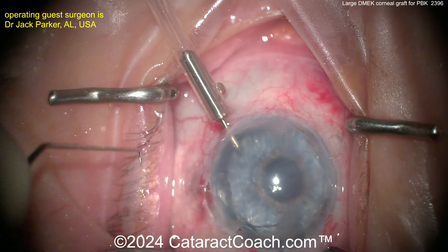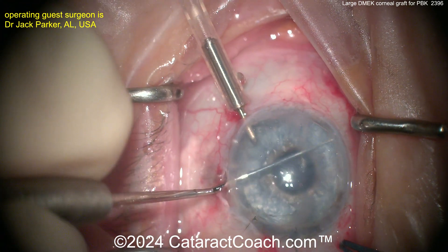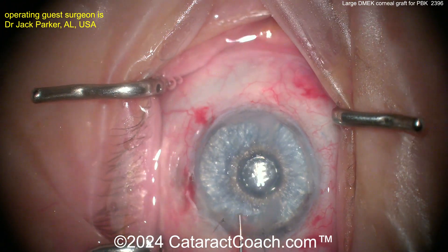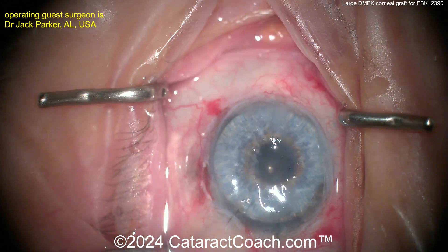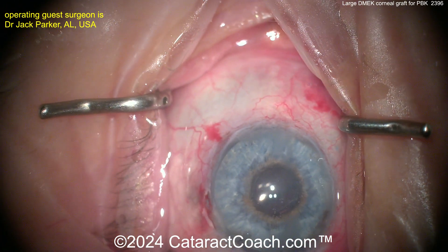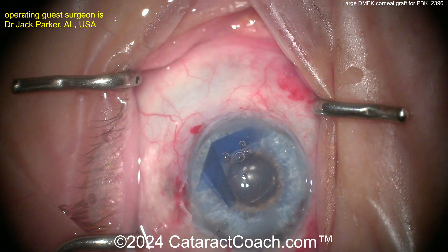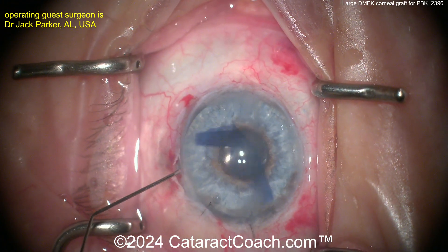Now refilling the eye with what looks like BSS. Still taking out the graft, just making sure — maneuvering it all around. That is definitely an artificial iris implant; that is a really complicated case. Now putting in some BSS in the anterior chamber, taking out that bubble, and getting the graft put in the eye. You can get these grafts in the U.S. — very easy to get preloaded, pre-made grafts that are inked and marked so you know the directionality. Here comes the graft, going right inside the eye, and then a surgeon who has a ton of experience with this will have a very easy time expanding this graft.